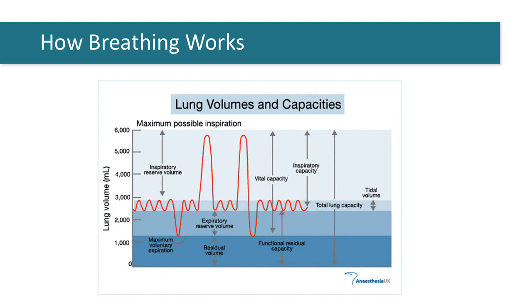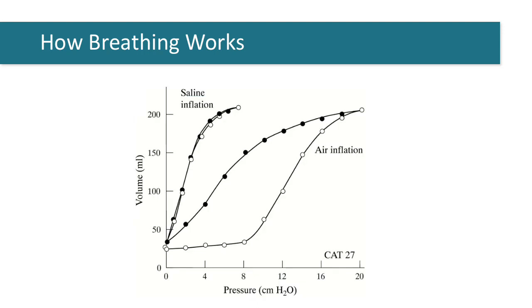When the total volume of lung available for ventilation is reduced, then the tidal volume takes up a greater proportion of the total lung volume available for ventilation, and this increases stress and strain within the lung. This is the basis for understanding how mechanical ventilation and breathing can actually injure the lung in the context of acute lung injury. During each mechanical breath, the lung is inflated by pressure and flow delivered by the ventilator or by the respiratory muscles.